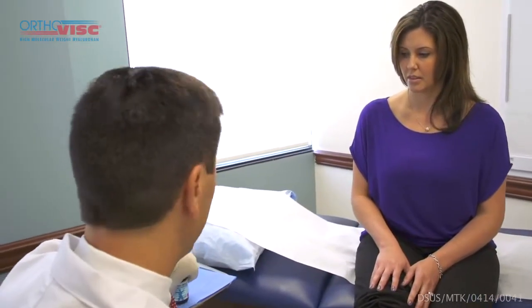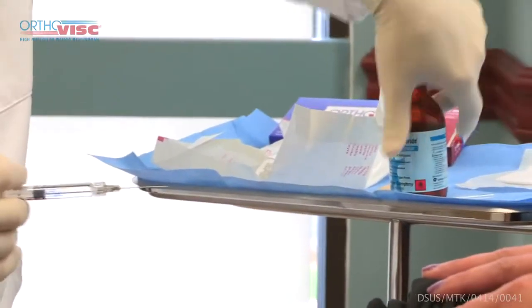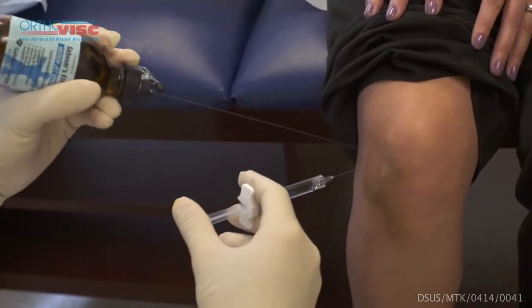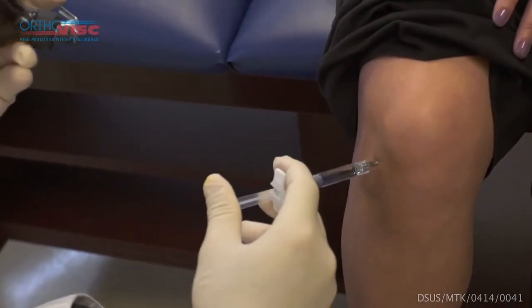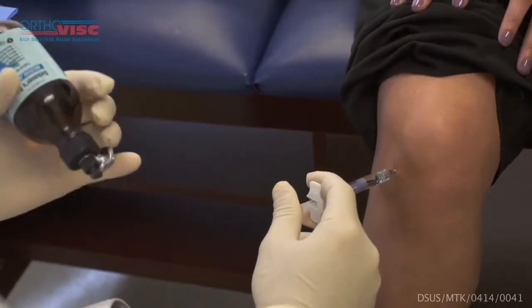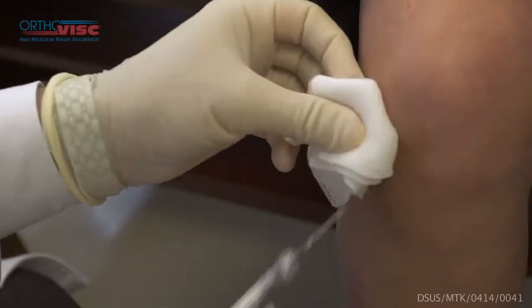Hopefully this will cause minimal discomfort in your knee and in the joint itself. Just a little bit of cold spray — nice and relaxed, nice and easy. After a couple of seconds I will go ahead and do the injection. If you have any discomfort let me know. You should feel some pressure at this point, hopefully not too much discomfort. And that's it. Any problems? Good — you don't feel lightheaded or dizzy or anything like that? Excellent.